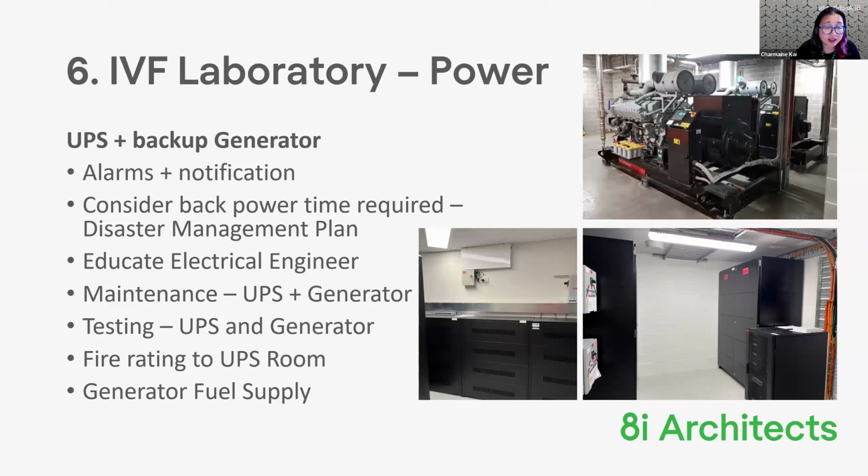With the generator and the UPS, regular maintenance and testing is absolutely critical. So make sure you've got a regular testing regime for both the UPS and the generator, to make sure that the generator kicks in when it's supposed to. The stories that have happened in recent years in Australia, and we don't get many blackouts at all, where the generator has not kicked in, have been quite devastating for the labs.